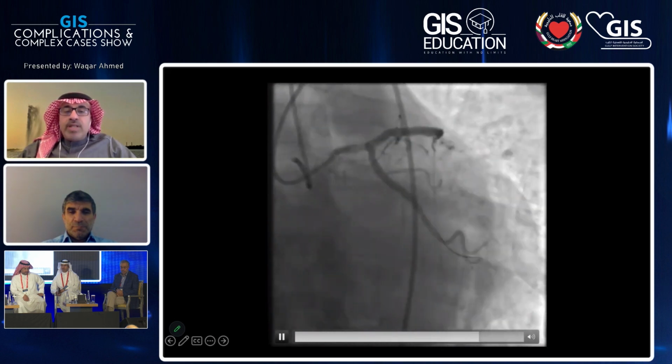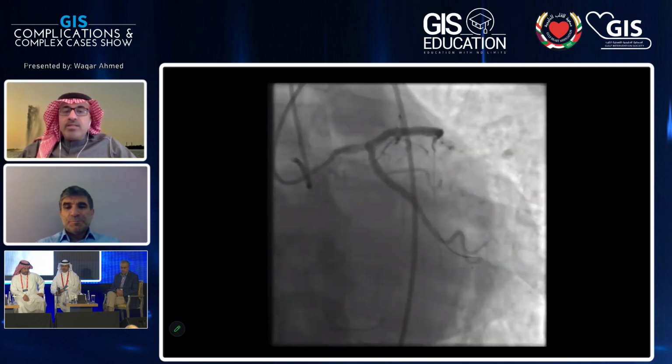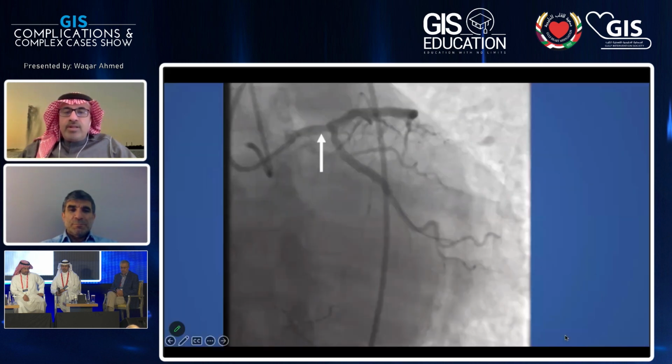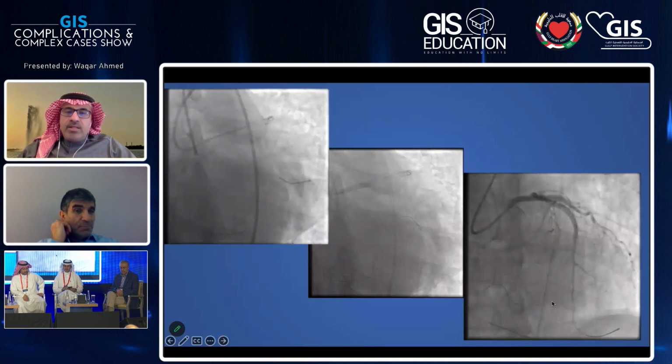Actually, one of our techs noticed something. He said, this left main doesn't look normal. And let's look at that. See this white shadow in the distal left main extending into the LAD across the circumflex. And that was the only clue I had that this is a dissection of the donor left main LAD. So that immediately took care of it.